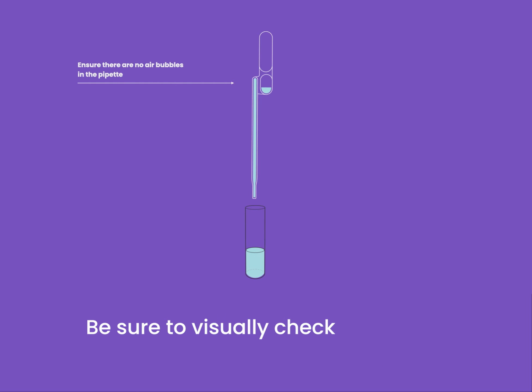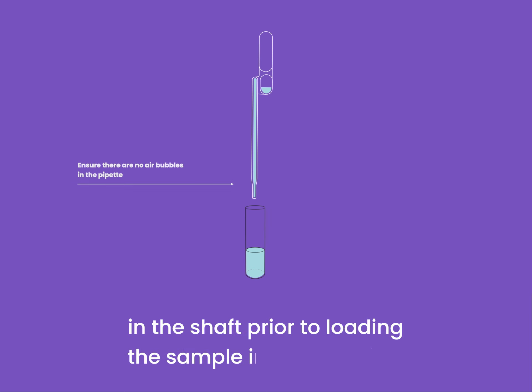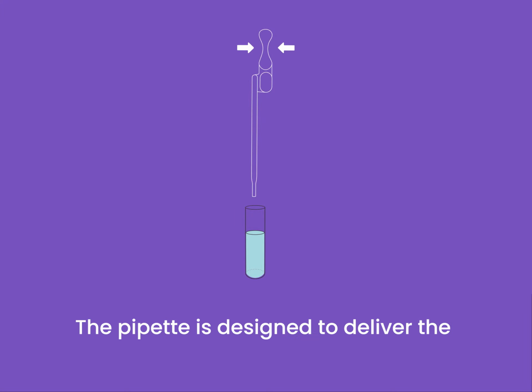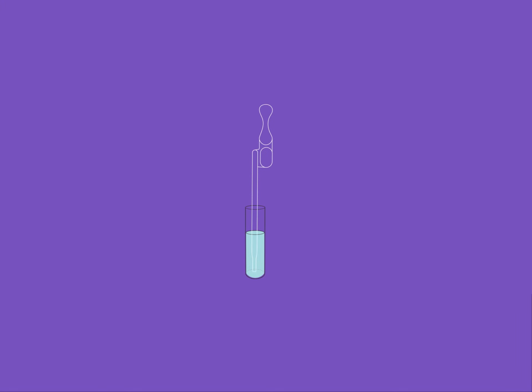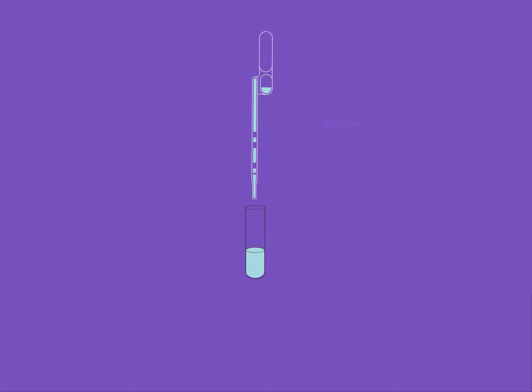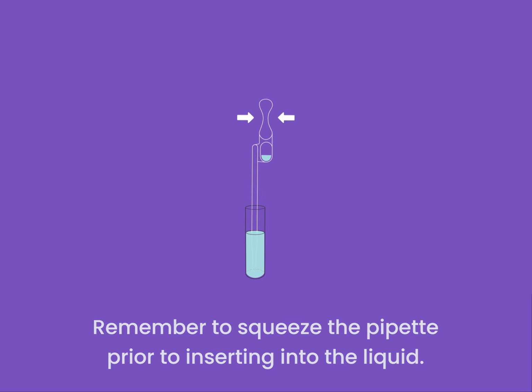Be sure to visually check to confirm there are no air pockets or bubbles in the shaft prior to loading the sample into the device. The pipette is designed to deliver the required amount of sample to perform the test. If air pockets or bubbles are in the shaft, an operator may squeeze the sample back into the tube and try again. Remember to squeeze the pipette prior to inserting into the liquid.